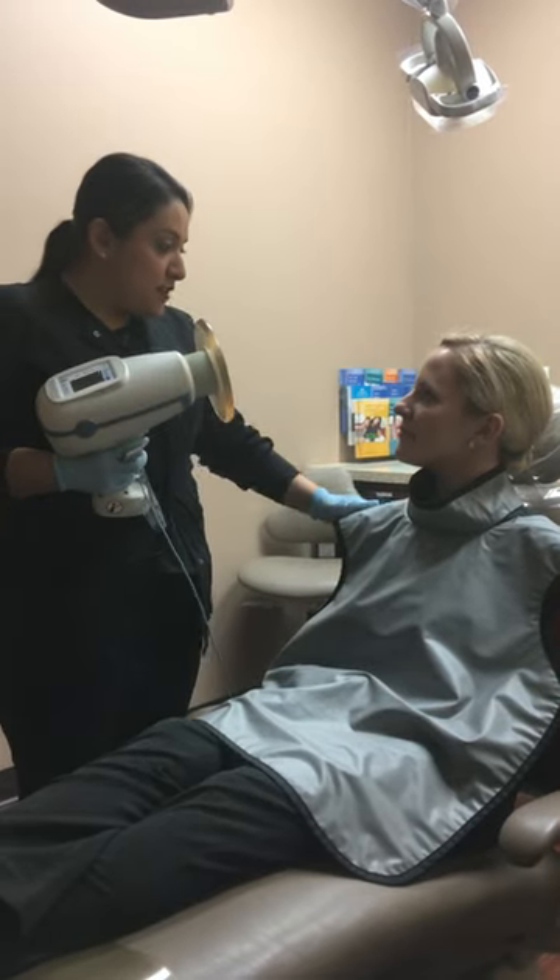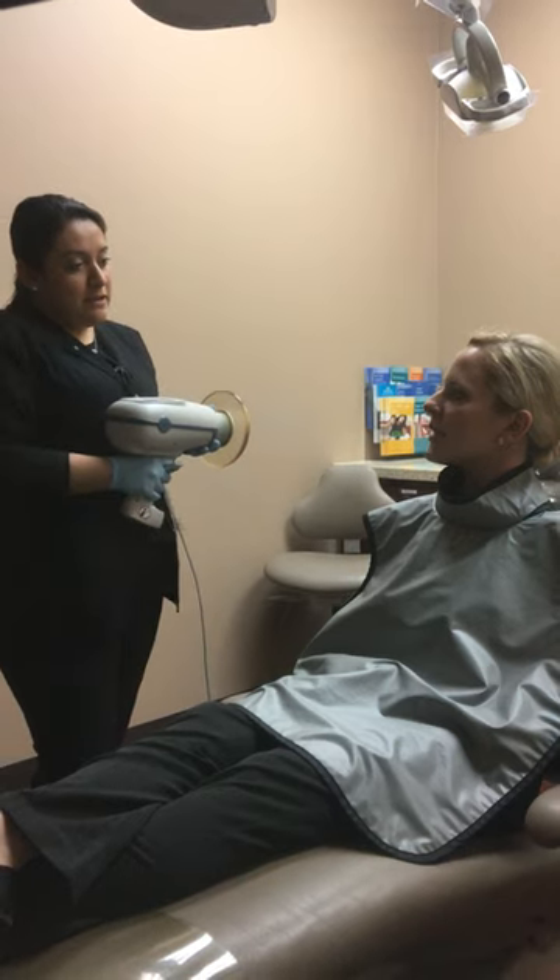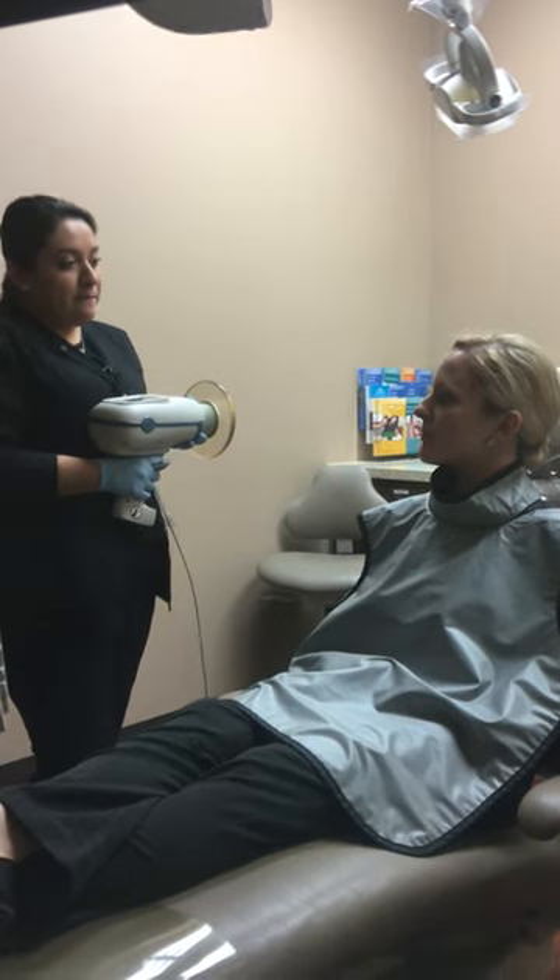Emily, I'll go ahead and put the vest on you now. We're going to go ahead and start with your x-rays. Is there anything that's mainly concerning you today? No. You're just here for a regular exam? Yes.